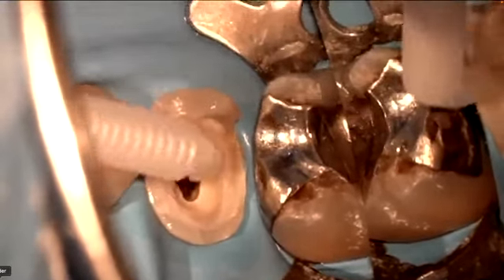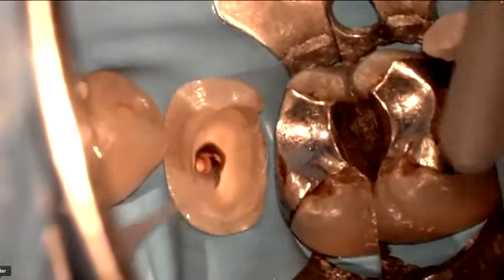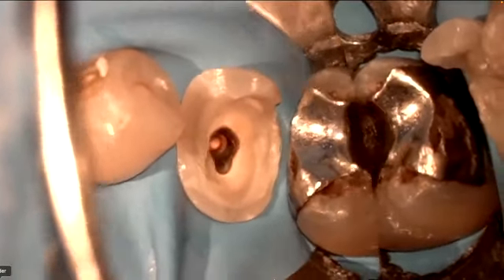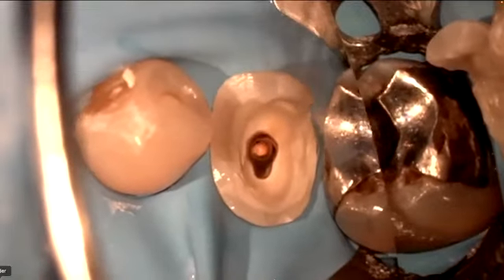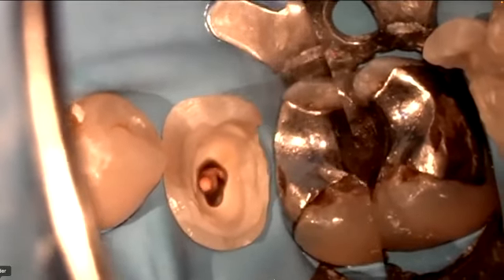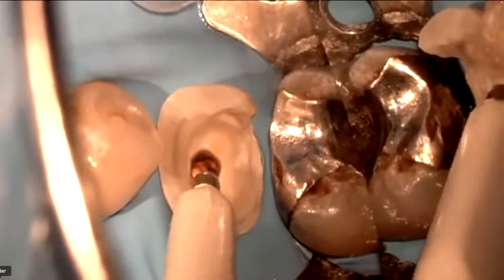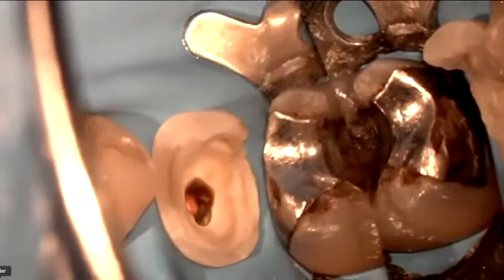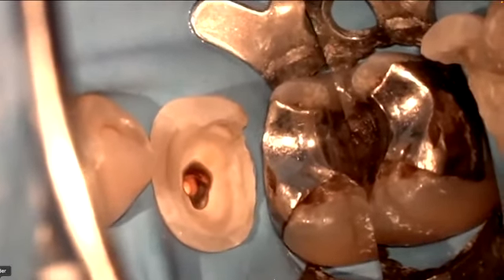I am using an active brushing technique in order to make the primer penetrate better into the dentinal tubules, and I'm leaving it alone for 1 minute. After this minute, I'm going to blow some air in order to make the solvent evaporate, and then I will be able to apply the bonding. And the bonding will be mixed with an activator in order to promote the light curing and to allow the parts of the adhesive that are not directly activated by the light to self-cure.